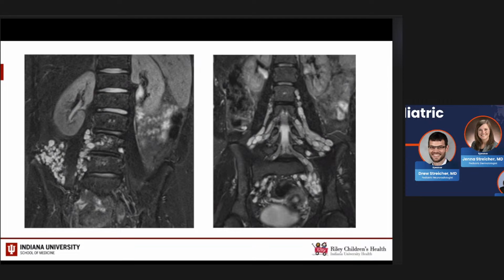So very extensive. I will say, for your NF1 patients in the spine, adding a coronal STIR can be very helpful, particularly when there are these plexiform neurofibromas, just to get a nice evaluation of the extent of these. Because if you just have your axial and sagittal images, it can be hard to get the full extent because they can be very, very large.